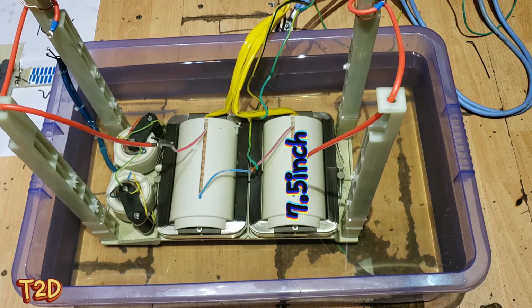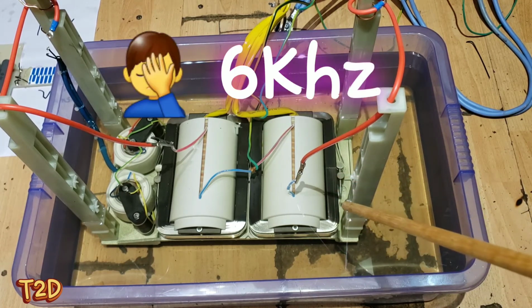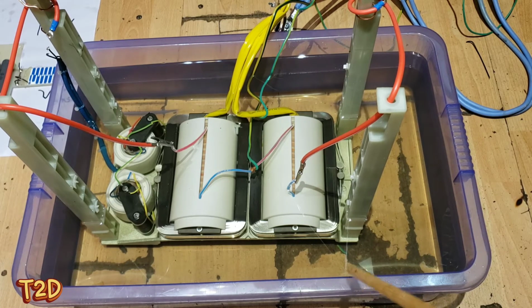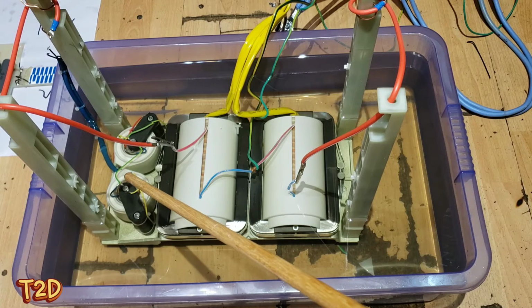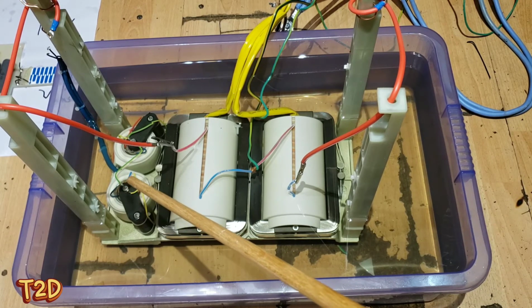So guys, this is the heart of this unit. These are the two transformers, and as I said earlier, these are iron core transformers, although they do run at 6 kHz. So the only difference is the laminations. The laminations in these are much finer than they would be in a mains frequency transformer, obviously to reduce the eddy currents. So over here we have the filament transformers, and obviously they just put out a small voltage for the filament in the tube, and that's transported alongside the high voltage negative.